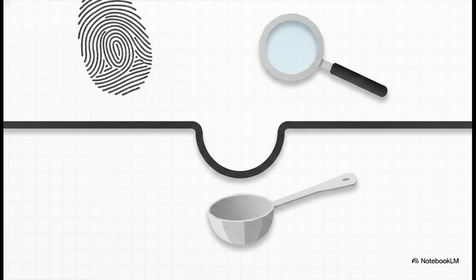Speaking of drugs, let's talk about digitalis. This toxicity leaves its own unique, undeniable fingerprint on our electrical crime scene. It famously causes the ST wave to look scooped out. Honestly, it looks almost like a ladle just took a chunk right out of the baseline. Once again, noticing the specific shape of this ST depression is exactly how a good detective knows it's the drug talking and not a blocked artery.